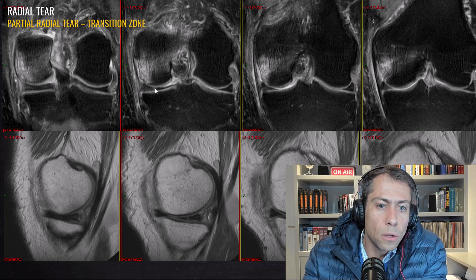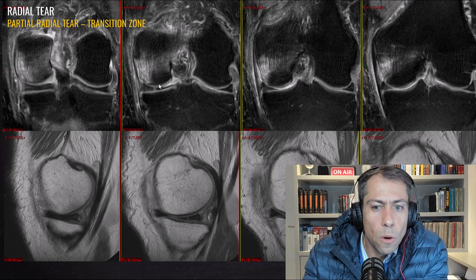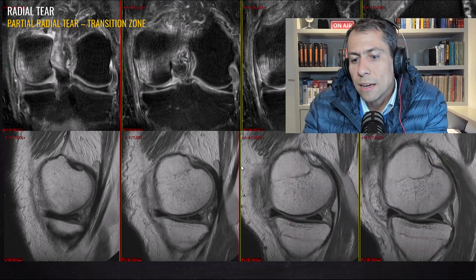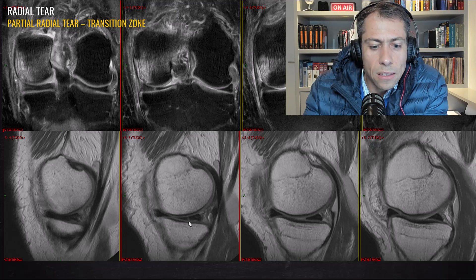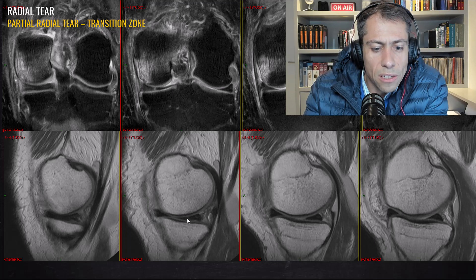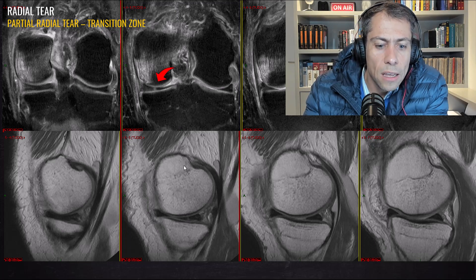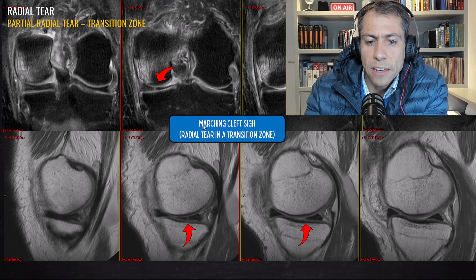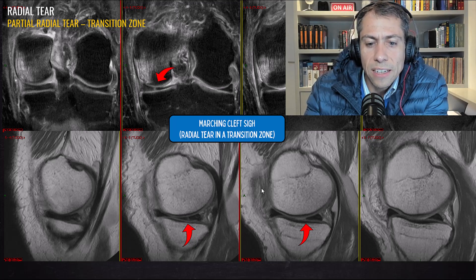This case here is a partial radial tear in the transition zone between the meniscal body and the posterior horn of the medial meniscus. In the coronal plane we can see the cleft sign in this region. In the sagittal plane we can see irregularity of the meniscus at the inner portion, and in the second image the irregularity of the tear in this region. So here is the tear on the coronal plane and on the sagittal plane, and we can appreciate the marching cleft sign.